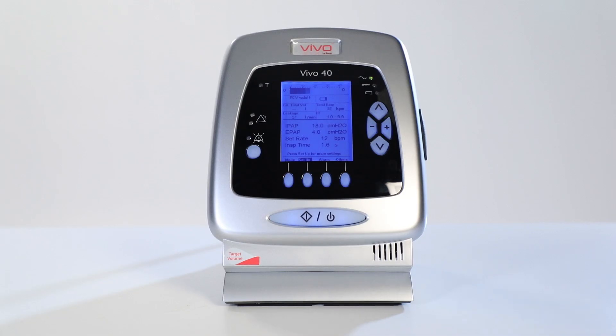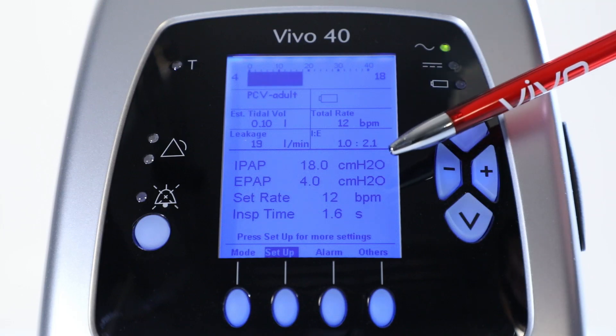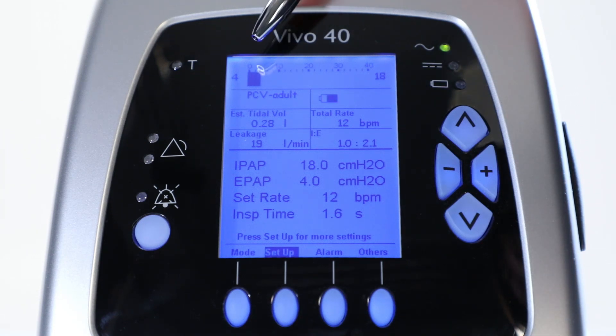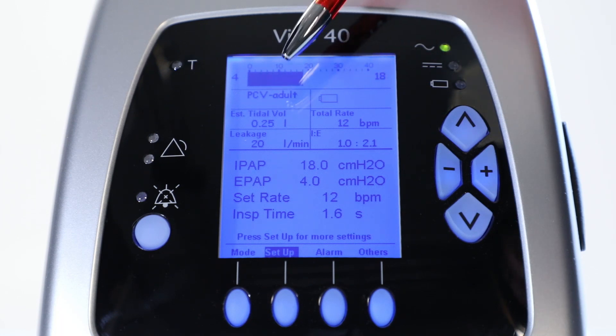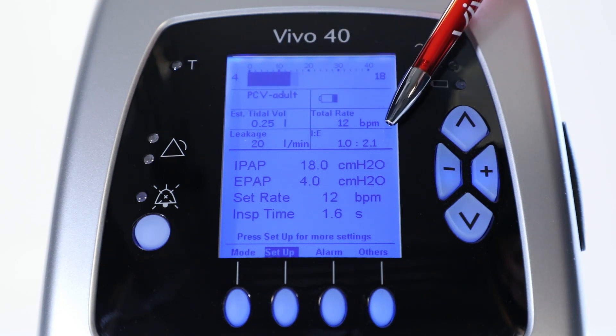The display window is divided into two parts: the monitoring section on the top, and the adjustable settings below. You can find and read measured parameters such as the pressures on each side of the bar graph, the delivered tidal volume, the leak value, the total rate, and the IE ratio.